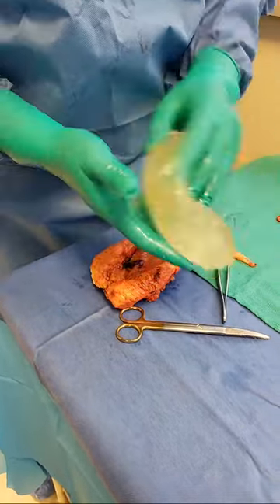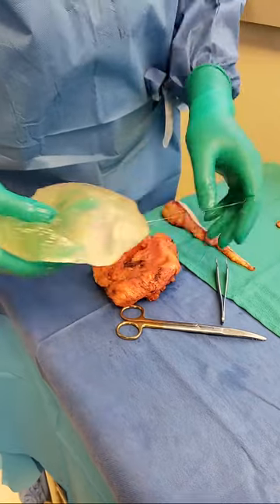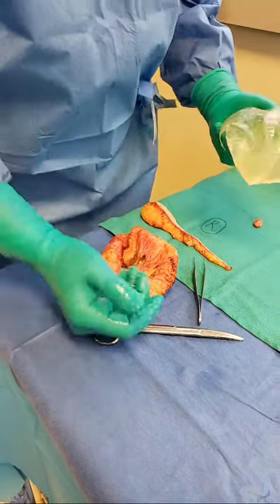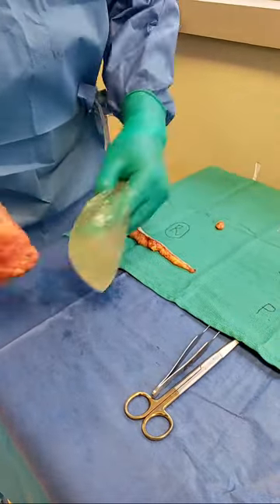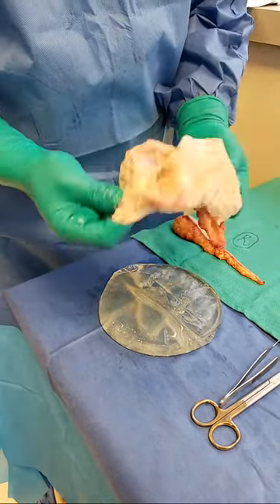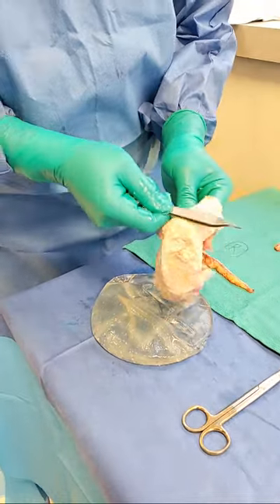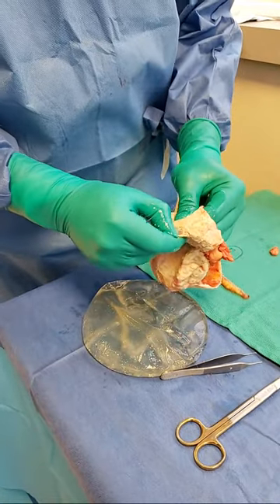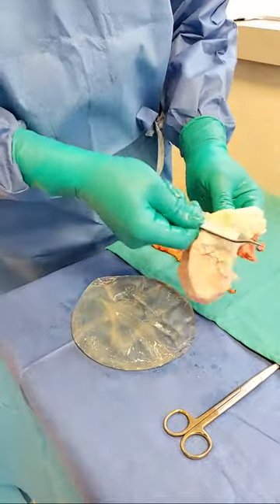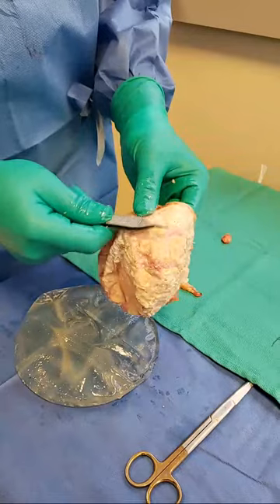Look at the color of it. I cannot read the make or the model, so I'm going to put it here. But overall, clearly, as you can see, ruptured. No implants are safe. If I revert this — look at this shell. This was resting right against her chest. Like the scales of a fish, literally — these are razor sharp. Don't tell me implants are safe. The implants are not safe devices.